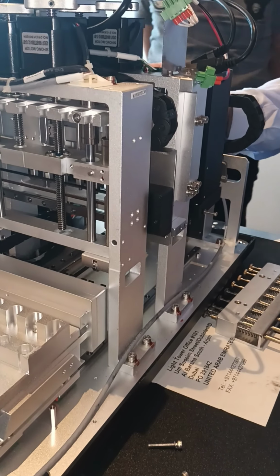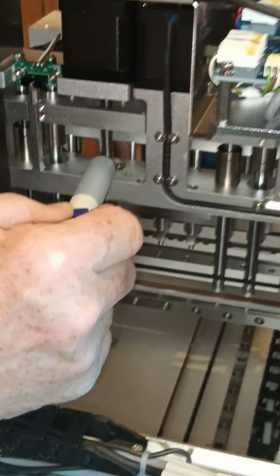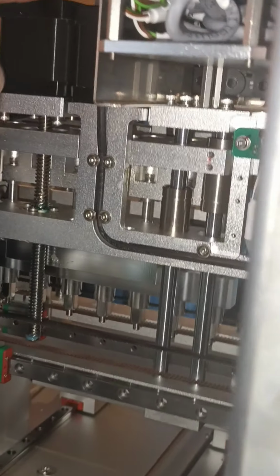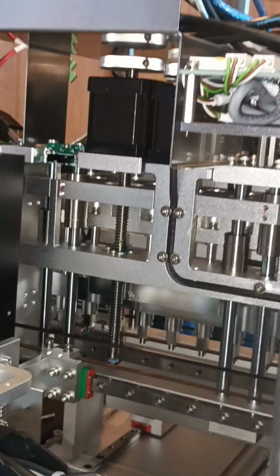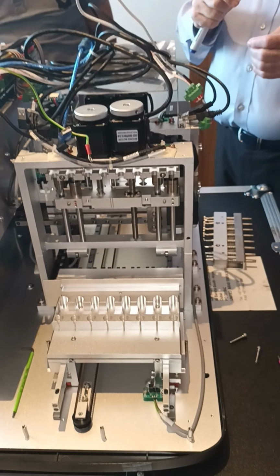This one is the rotary type shaft. And this is the linear bearing, which is exactly the same sort of one. When I'm turning the motor, there is no gap between when I start to turn and when the actual movement appears. So my advice, no matter what, do not play with the bearings. First time you take the incubator out of the rails, you'll kill the bearing. Of course, all the balls will start to fall out. Have a wonderful time cleaning them, putting them back, and then greasing.